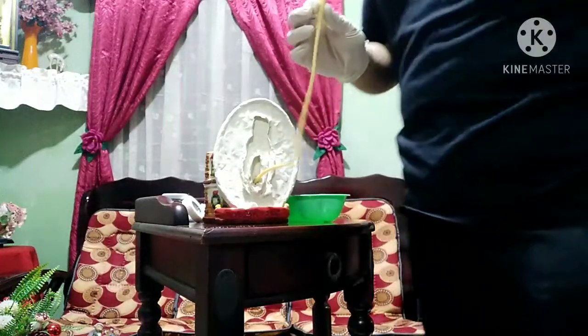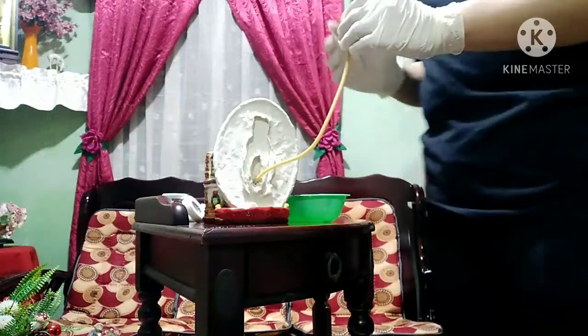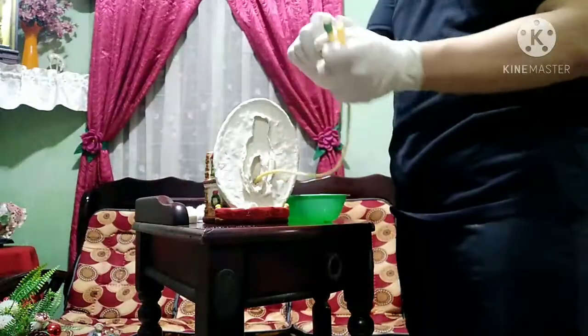Then 20 po is obtain urine specimen in a sterile container if ordered po. So, magko-contain po tayo ng specimen po. So, ito po yung container.